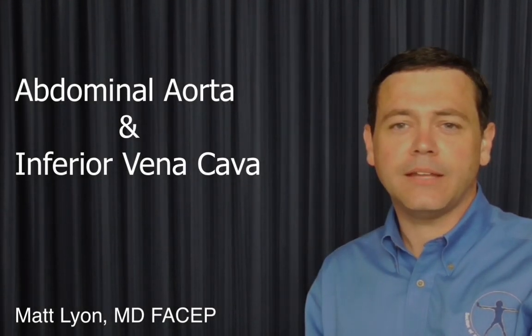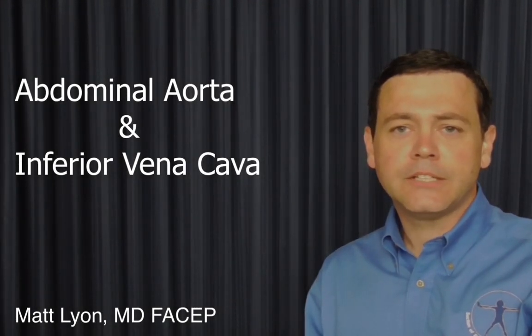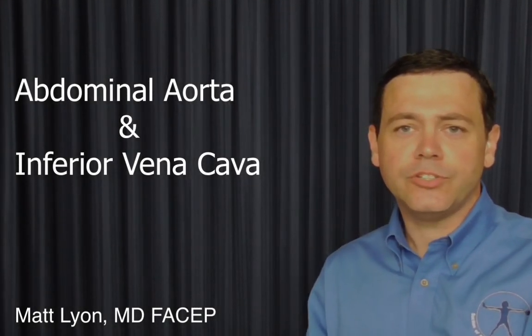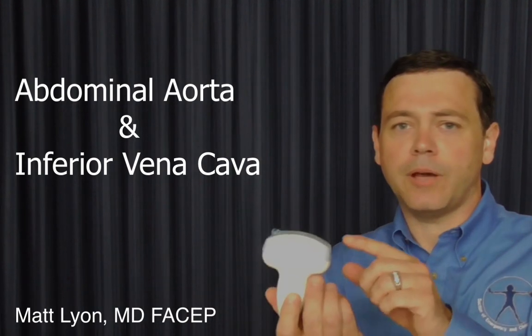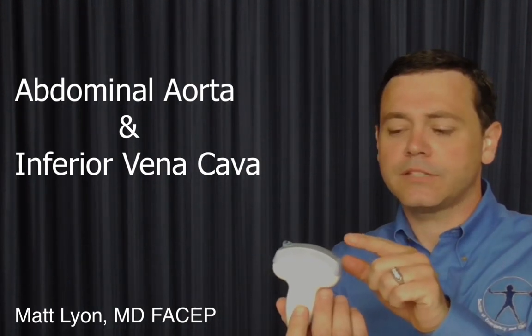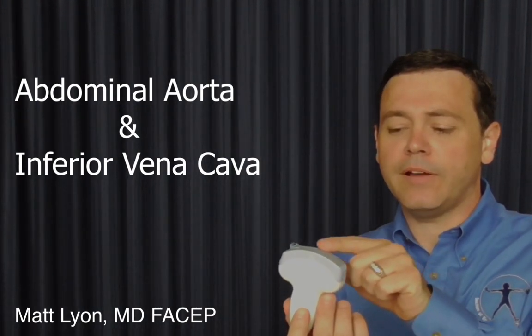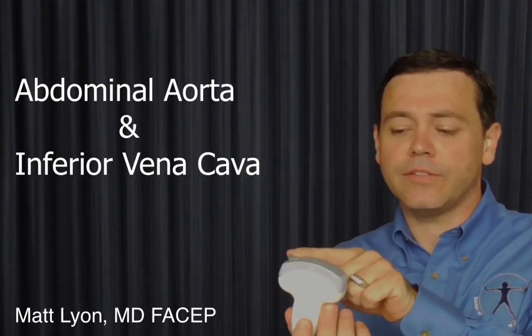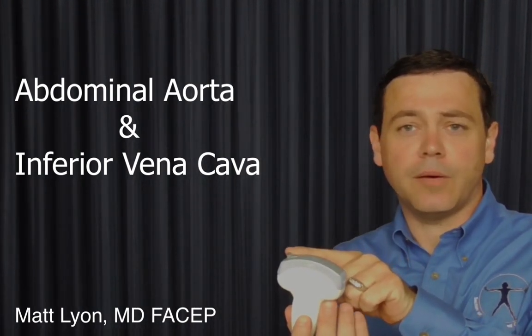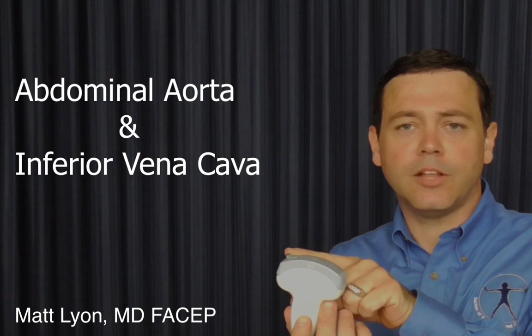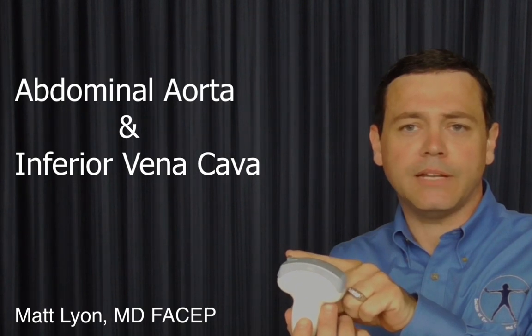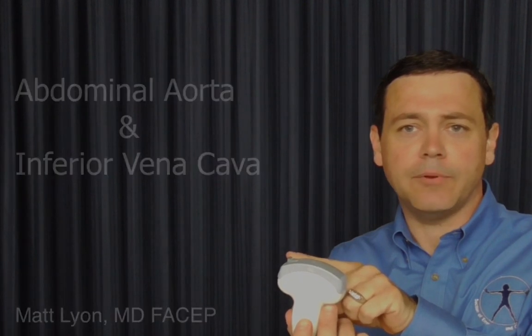Hello, I'm going to show you how to obtain images of the abdominal aorta. To do this exam, we should use a curvilinear abdominal probe. This curvilinear abdominal probe has a curved face on it, which is how you know it's the abdominal probe. It's a low-frequency probe and can image anything in the abdomen.